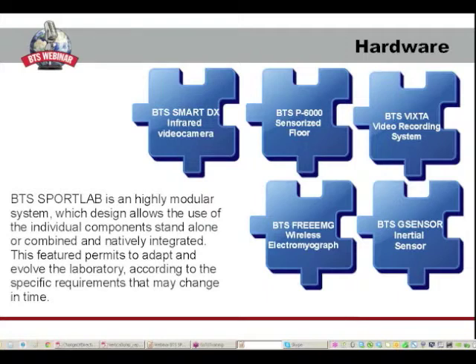As regards wireless devices, we have the chance to add different kinds of technologies. In particular, we can add one or more force platforms, BTS P-6000, up to 16, until to have a sensorized floor, and in this way a complete force analysis is done.